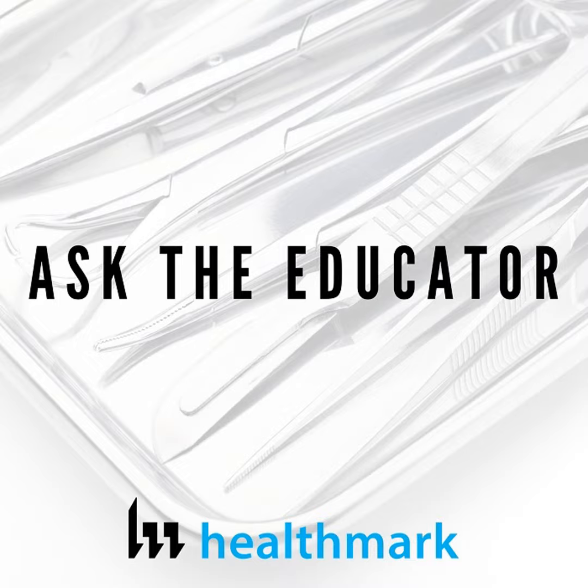Now one of the key takeaways there, in my opinion, is that all of these shavers were dirty, and yet some of those facilities had borescopes and some of them did not. So even the facilities that had the proper inspection equipment, unfortunately, were not always producing a clean shaver. Now, obviously, it's a smaller sample size. When you go in, you just spot check a shaver or two or what have you, whereas there's a possibility that they've gotten some clean otherwise. But generally speaking, we're seeing every single shaver is dirty, which is not a very good percentage, unfortunately.